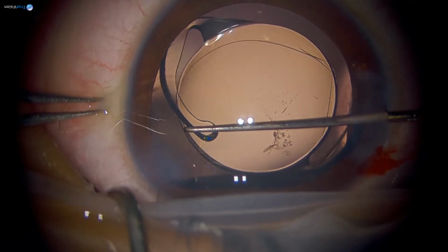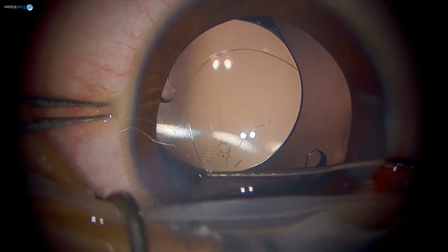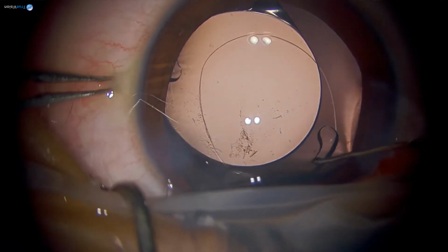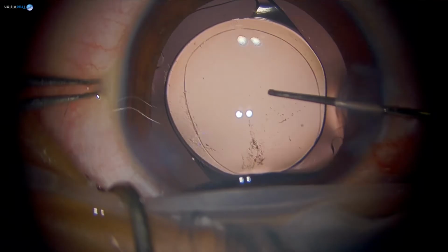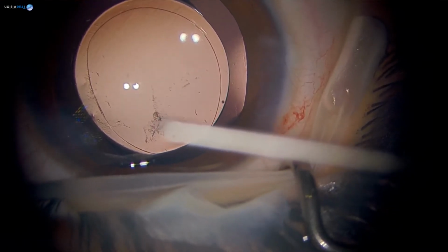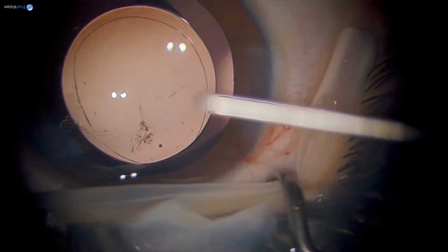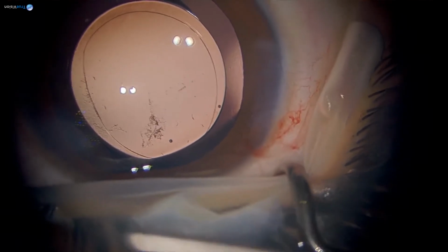So the first target is just to push this in, and then you can just nudge it in. No need to rotate too much in pediatric cataract. Do I go pars plana or do I go anterior vitrectomy? Both are fine. My personal preference is through this port. It makes things easier because I do not have one more incision here. I go with one incision.